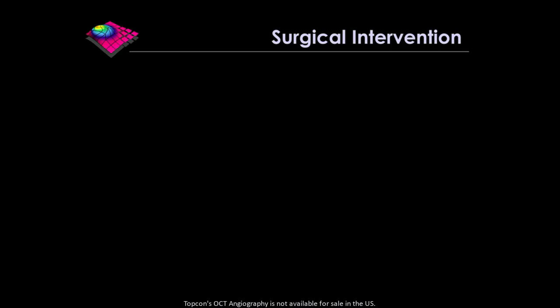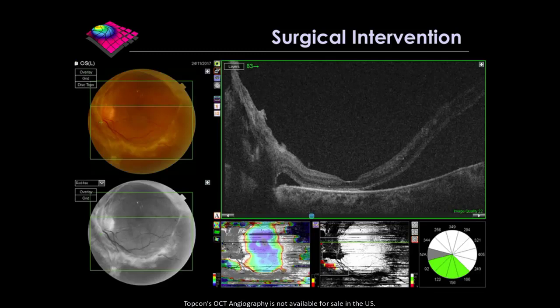But what's interesting is when we look at the OCT. We get the Triton scans and look at her fovea now. And remember how her fovea in that left eye looked just a few months ago. And now it's almost as if her fovea is about to come off any second. And her vision is 6/9. And okay, maybe you might be able to make that out clinically if you're paying attention and you're quite good, but actually it's really quite easy to look into these eyes and not necessarily see the extent of the tractional changes.